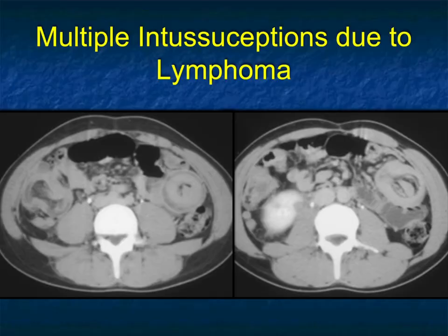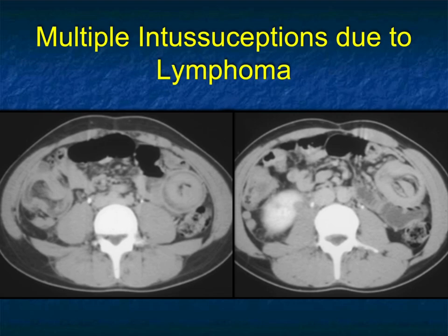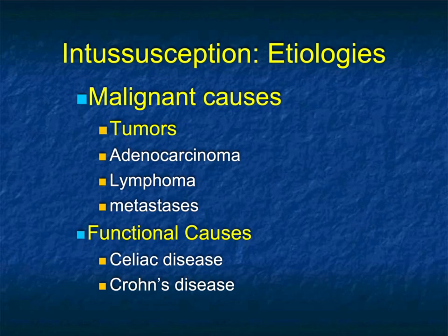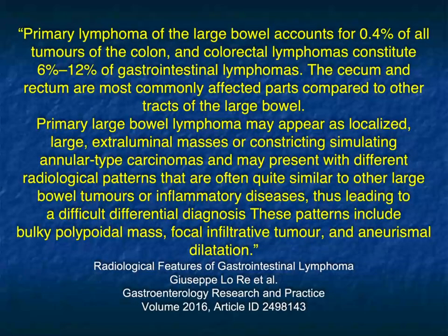As mentioned for small bowel, polypoid lesions can intussuscept. Here's a patient with multiple intussusceptions due to multiple polypoid lesions. There's also tumor in the patient's right kidney — also due to lymphoma. When thinking about intussusception causes, tumors are at the top of the list: adenocarcinoma, lymphoma, and metastases. There are also functional causes like celiac disease and Crohn's disease, as well as many benign tumors.